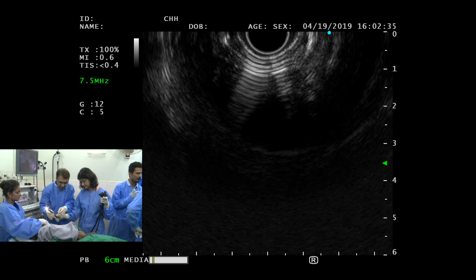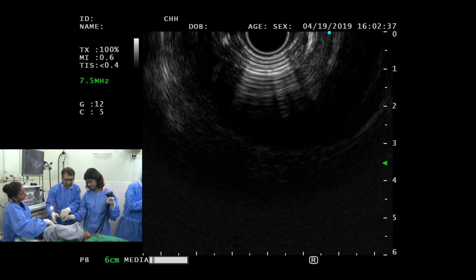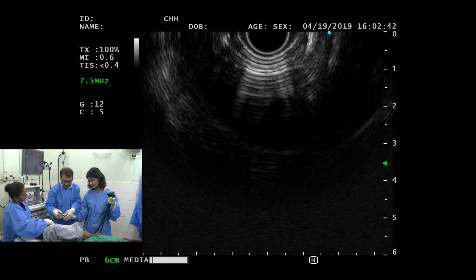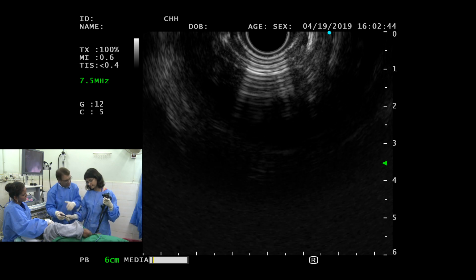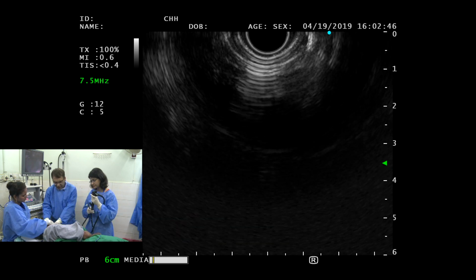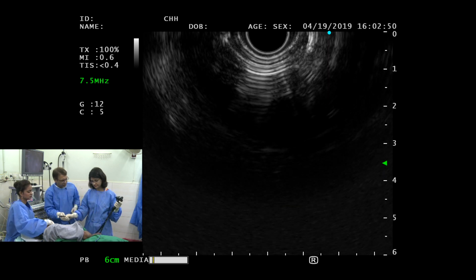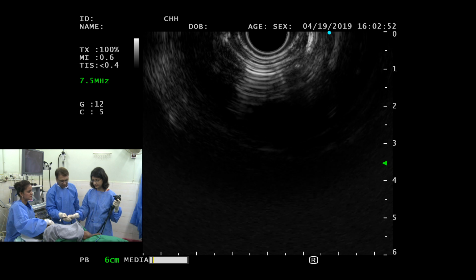So if you hold it from here, you don't have much space. So always try to hold it at 25, 23, 22, it should be after 20. So if you look at the scope's movement, keep the scope like this, big wheel towards you, you see that, like how it's moving.